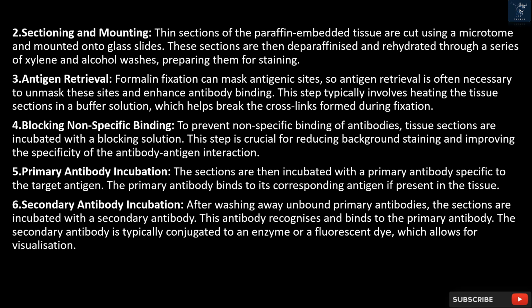Secondary antibody incubation. After washing away unbound primary antibodies, the sections are incubated with a secondary antibody. This antibody recognizes and binds to the primary antibody. The secondary antibody is typically conjugated to an enzyme or a fluorescent dye, which allows for visualization.